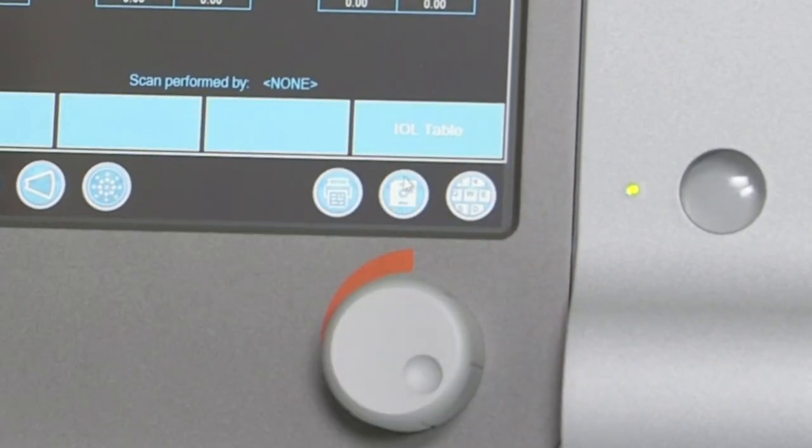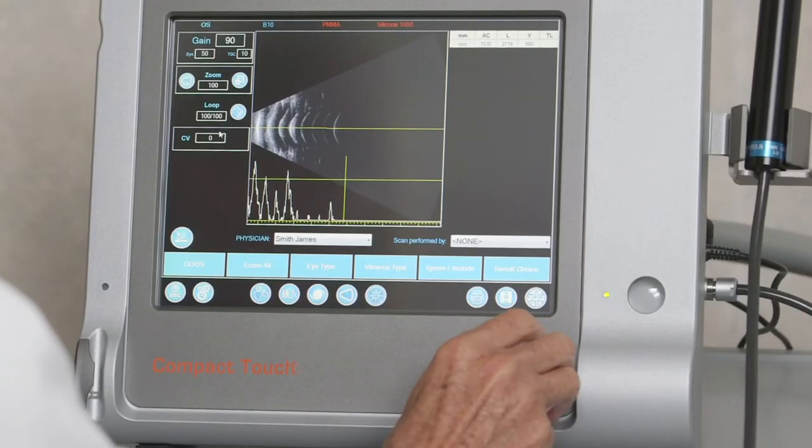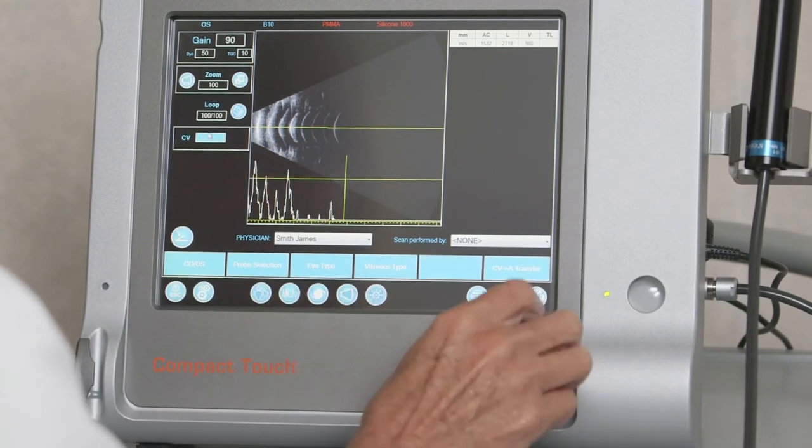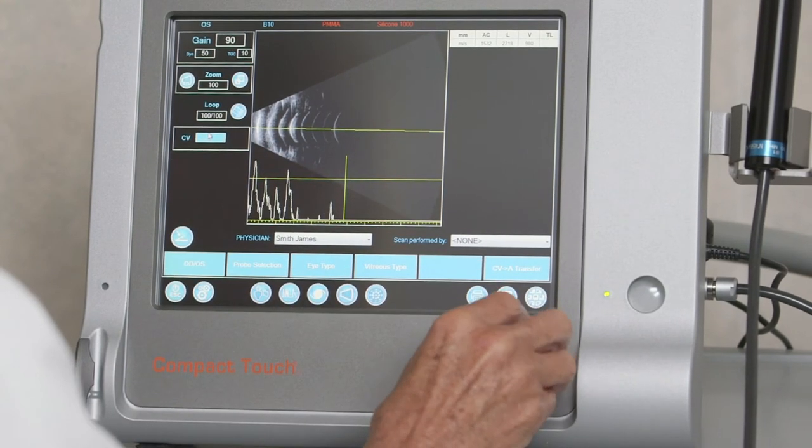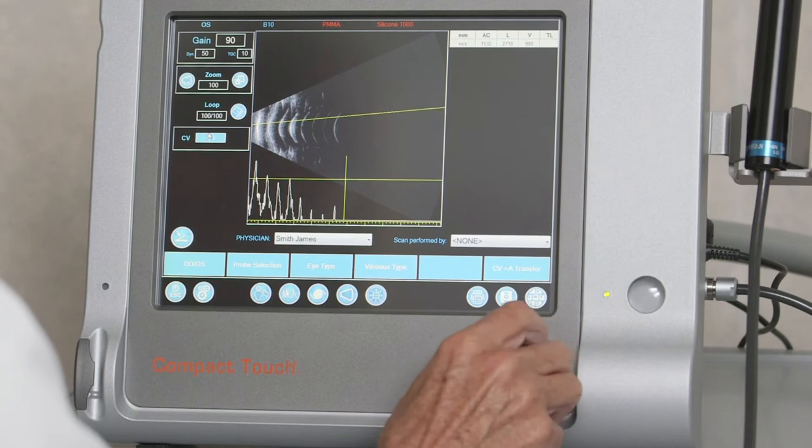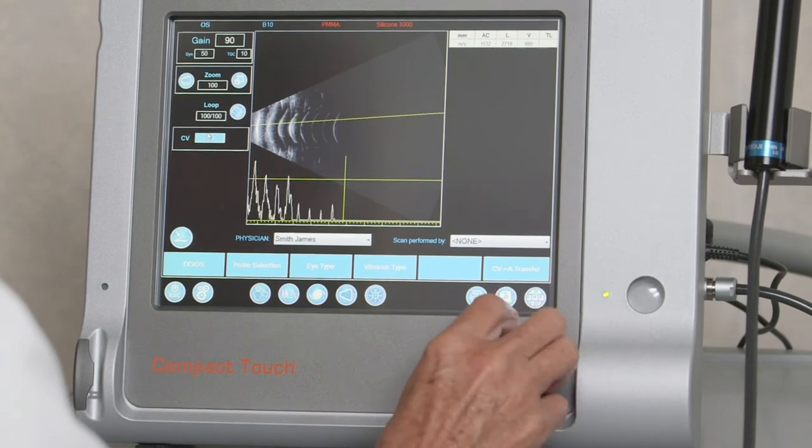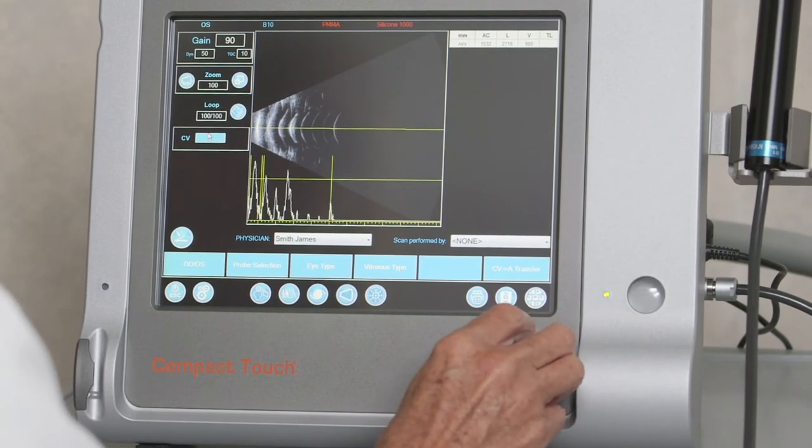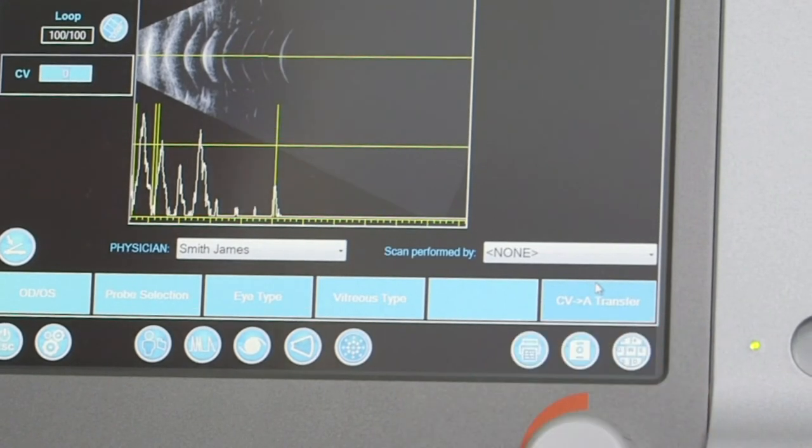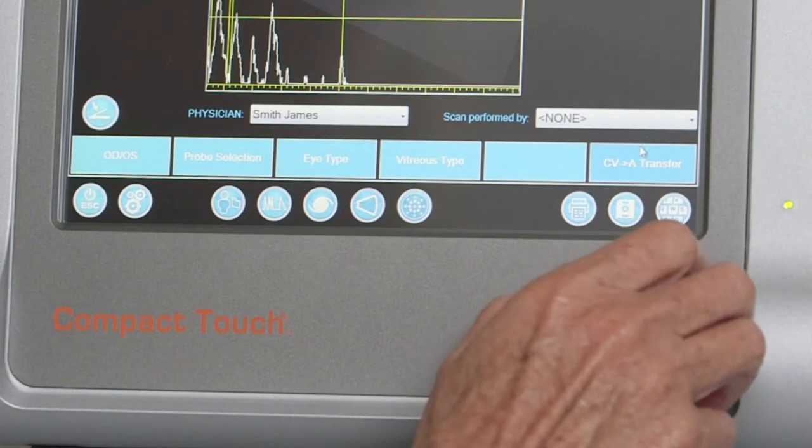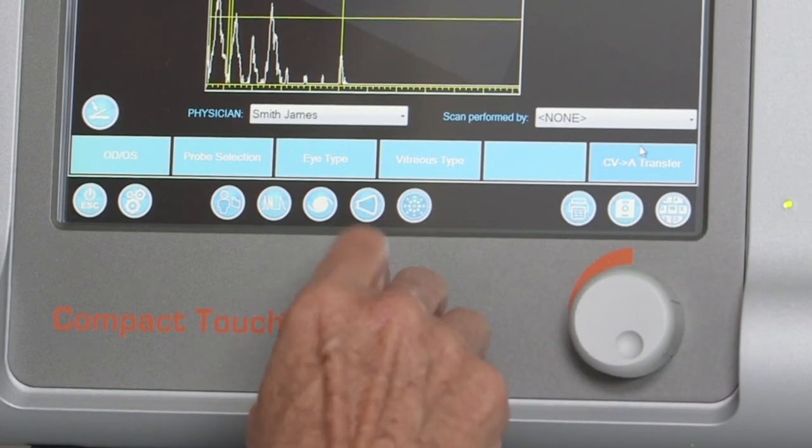Results can be saved by touching the save icon at the bottom or printed by selecting print. For B-mode guided biometry performed with the 10 MHz B-scan probe, the position of the cross-vector C-V line can be adjusted by left-clicking and moving with the mouse, or by changing the value in the C-V field. Touching the C-V-A transfer button at bottom right adds the measurements from the selected scan into the result table.